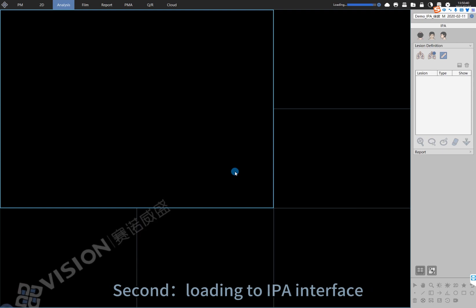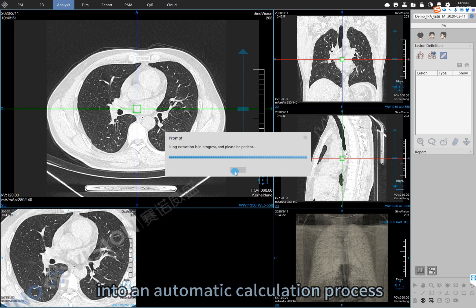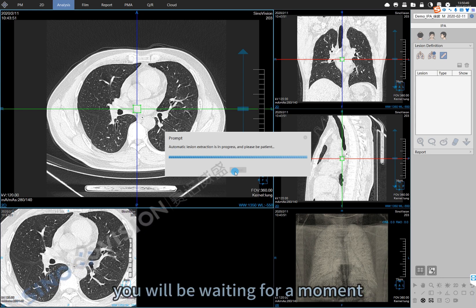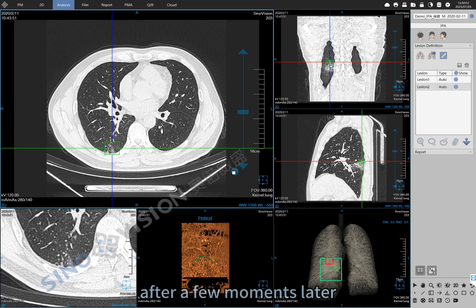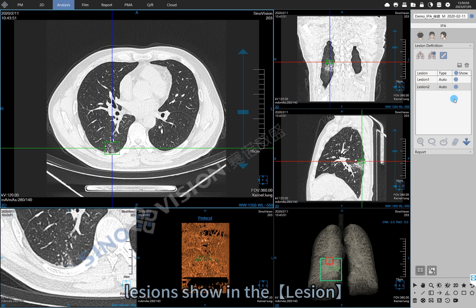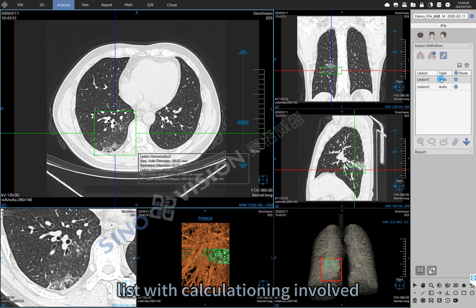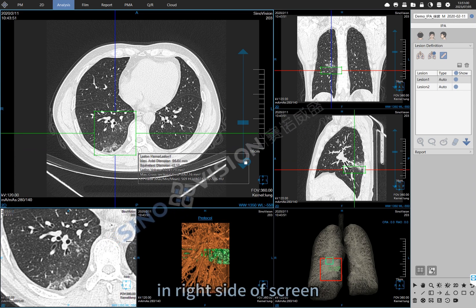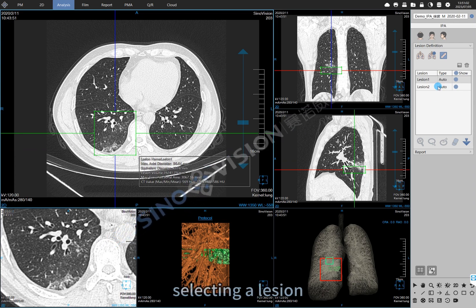Second, load to the IPA interface. The system will enter into an automatic calculation process — you will be waiting for a moment. After a few moments, you can see single or multiple inflammatory lesions shown in the lesion list, with the calculated involved volume of each lesion area displayed on the right side of the screen.